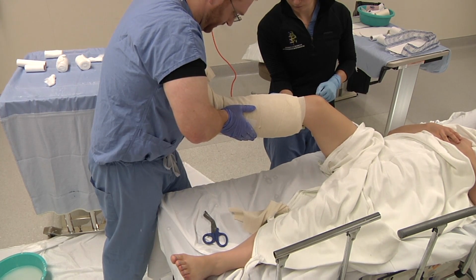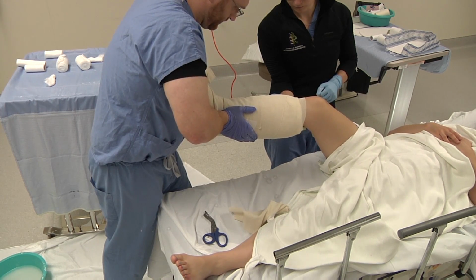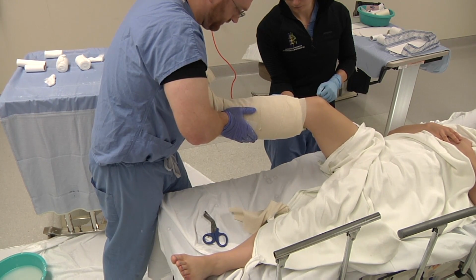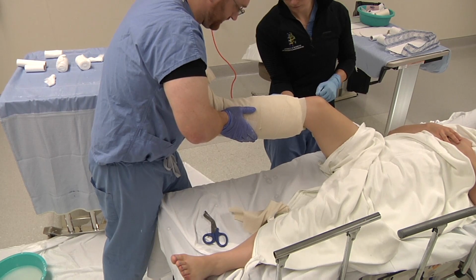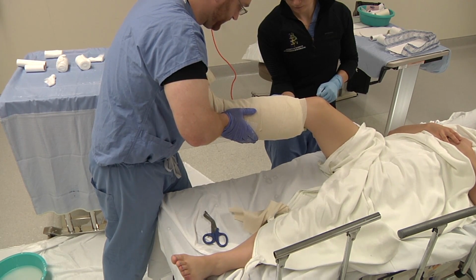You can use a mini C-arm at this point to check your reduction. In unstable, very unstable fractures, it's beneficial to sometimes do that at the beginning to make sure that you can get a reduction before you apply splint and padding.